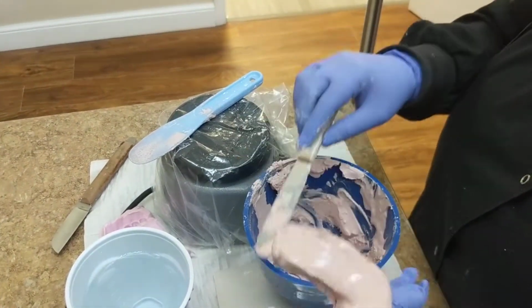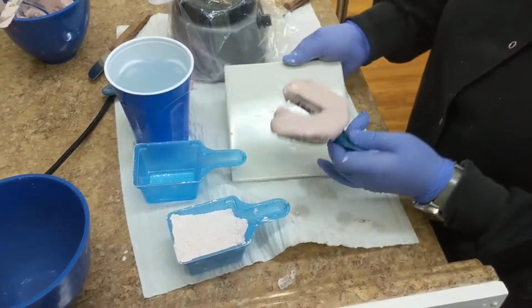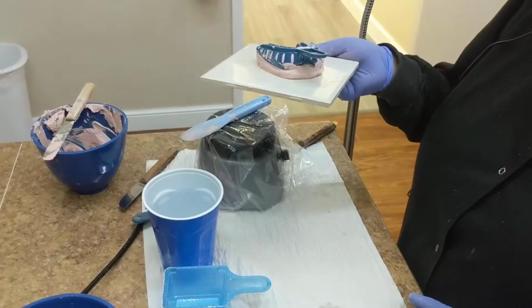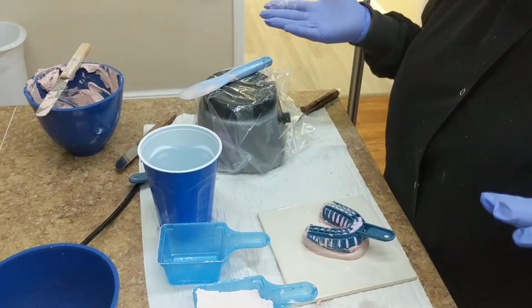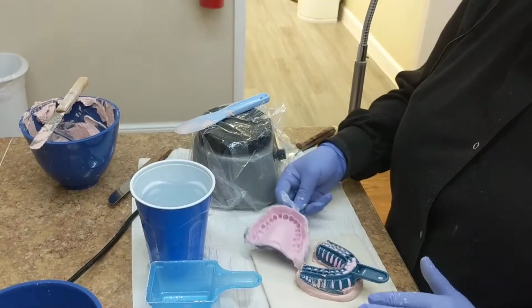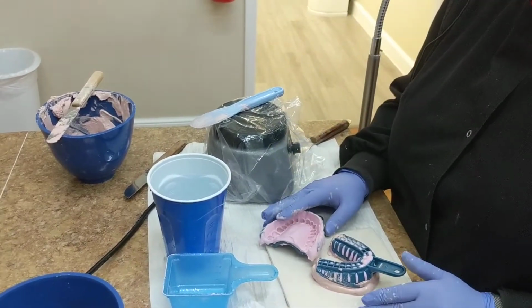So after you do your base, you're going to flip your impression on the tile like this and wait for it to set. And you do the same thing with the upper, okay? So this was the bottom. I'm not going to do that because it's the same process, but that's how you pour an impression.